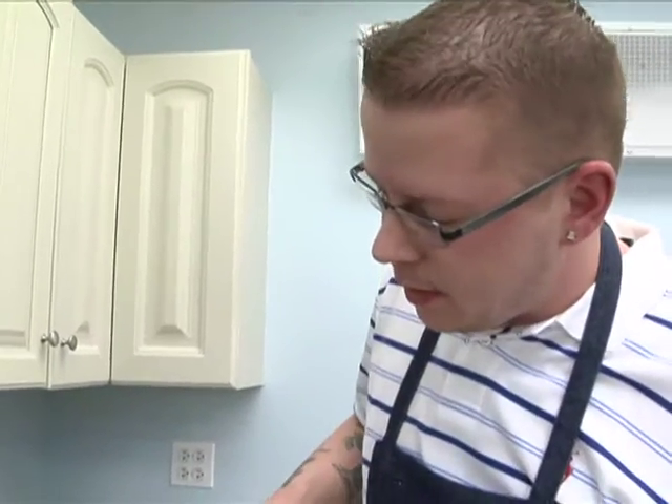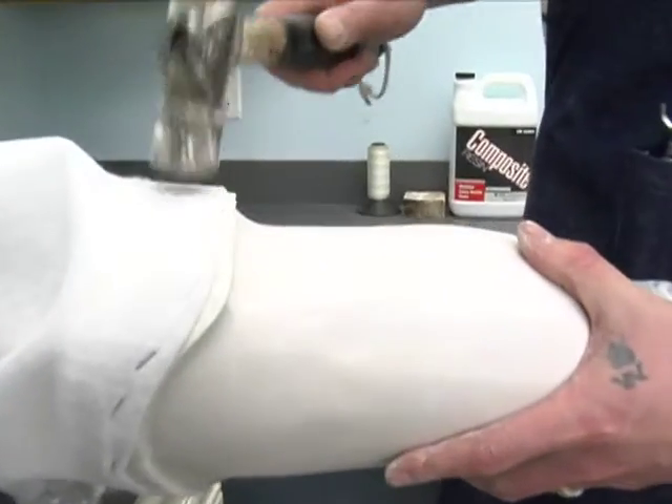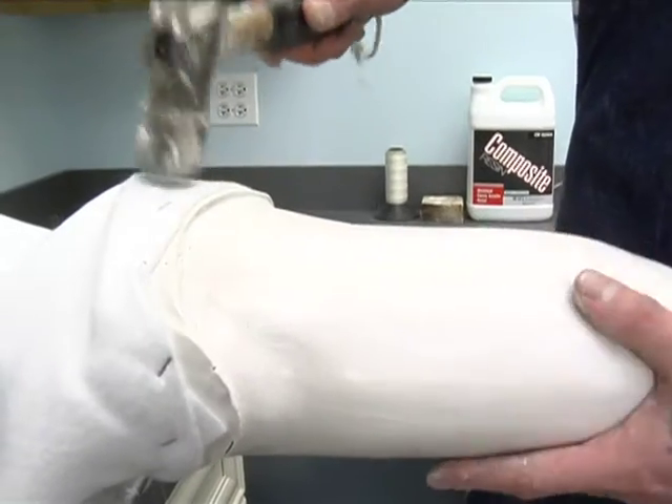You can go ahead and use a hammer and make sure these staples are in all the way. These could potentially rip the PVA bag we'll be applying in the next step.